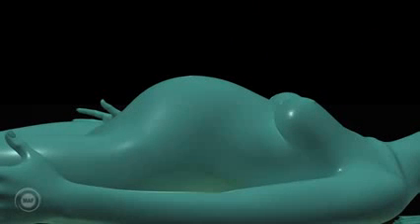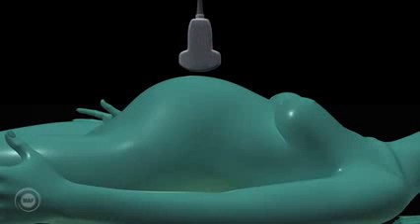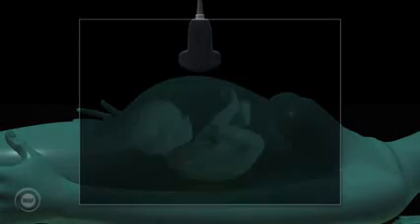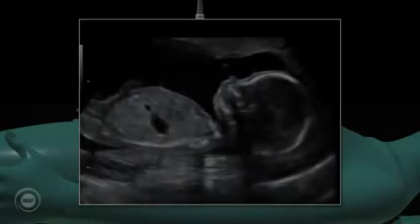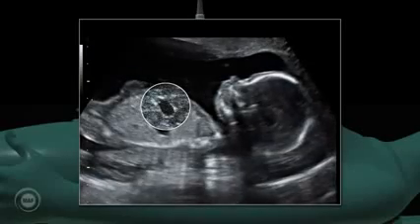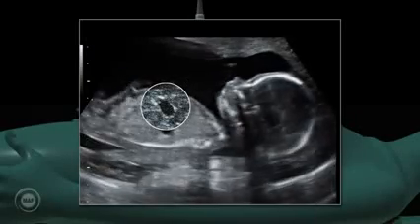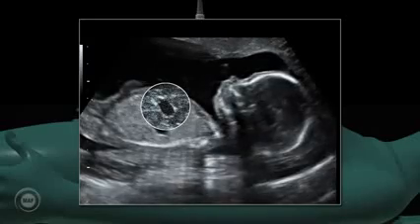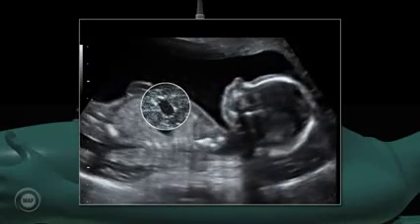known as acoustic impedance. So part of the sound energy is reflected by the tissues and part continues to travel through until it hits other tissues and is reflected back. The image is produced from the reflected sound waves as they come back from the different tissue interfaces, and that impulse is registered on the screen as a dot. Thousands of these dots produce the complete image, which is a composite of all the returning signals.